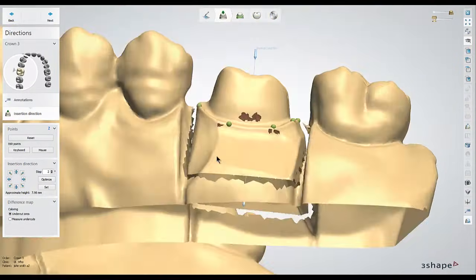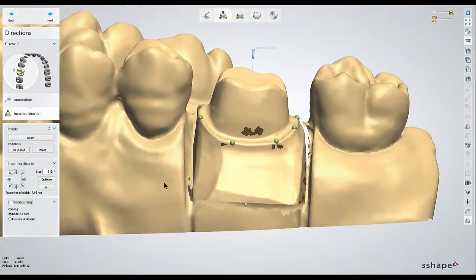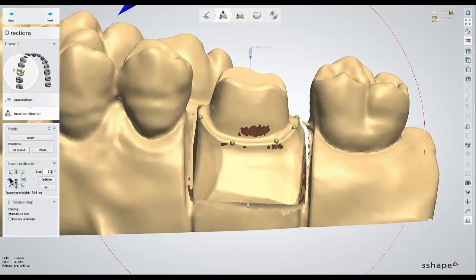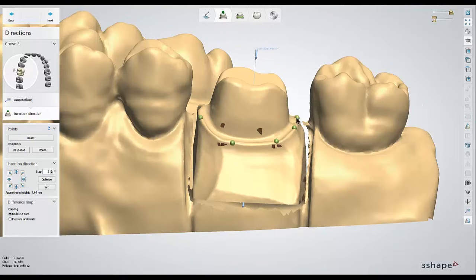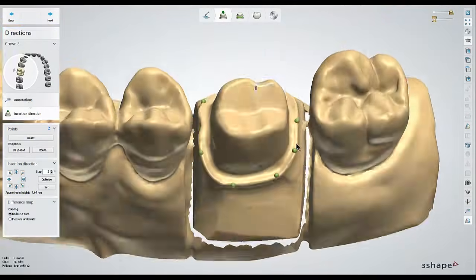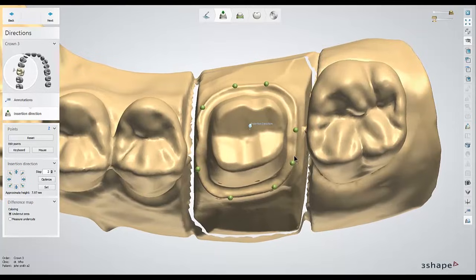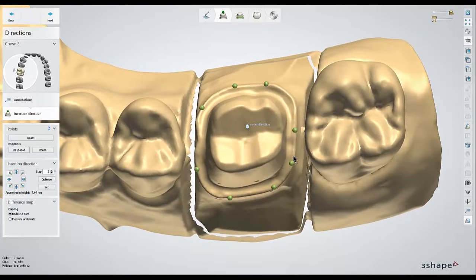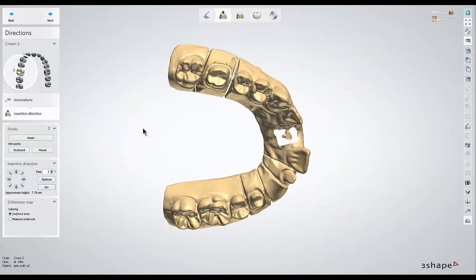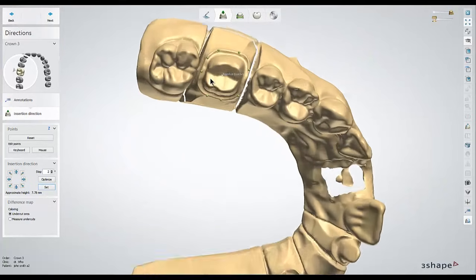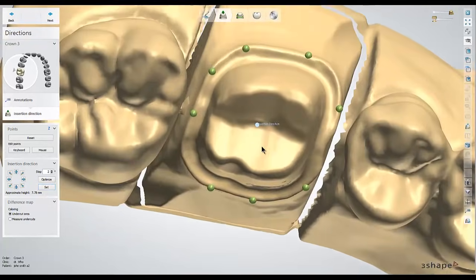The default insertion direction is usually pretty good, but if you do need to make any adjustments you can use these arrow keys to adjust the angle and you'll see the red undercuts change. Or if you can find a good view from the occlusal view, you can hit the set button to change the insertion direction to wherever you were looking from at the time.